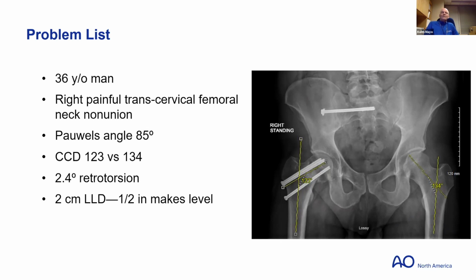So what I would do is a modest abduction, probably, as Roger said, enough to get him down to a trochanteric tip at the hip center. You can see on the other side, he has mild varus in terms of that definition of varus. And then I would internally rotate him by at least 15 degrees, probably 20. I don't think that 20 degrees of rotation would be a problem. And that'll make it happy.